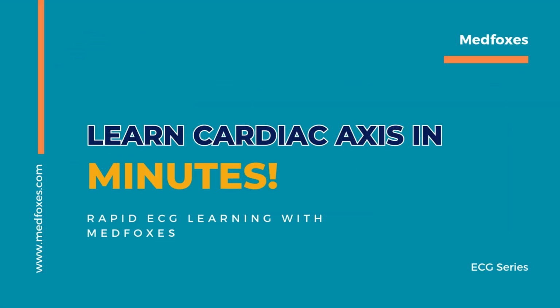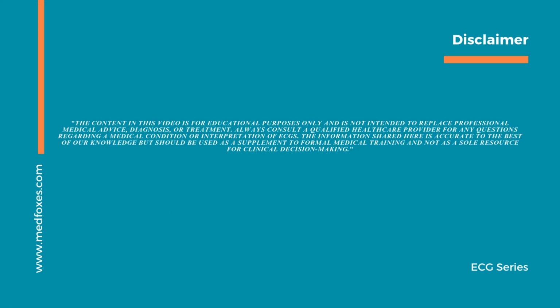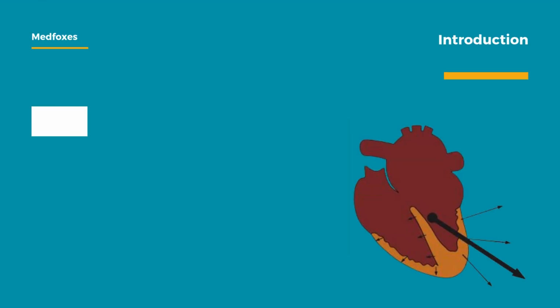In this video, we are diving into an essential concept in ECG interpretation, the cardiac axis. Understanding the cardiac axis is a critical step in analyzing the heart's electrical activity, and it can provide valuable insights into underlying cardiac conditions. Whether you are a medical student, healthcare professional, or just curious about ECGs, this video will break down the topic in a simple, practical way.